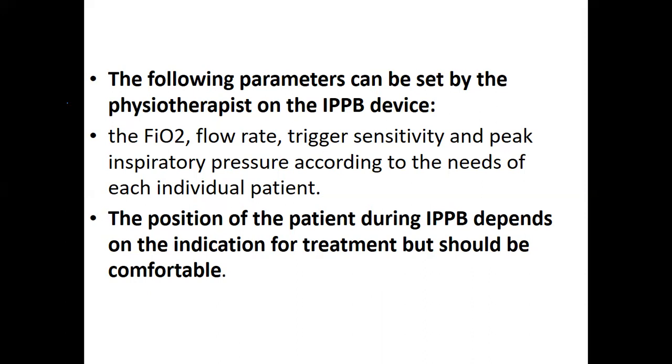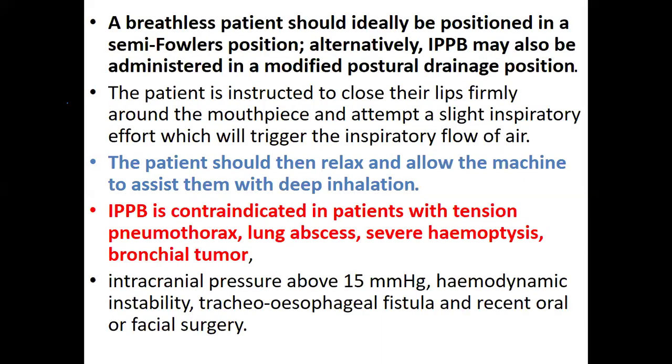So meaning you assess the patient and position them in the most comfortable position. Mostly it could be semi-Fowler's position, in which you can safely administer this technique. The patient should then relax and allow the machine to assist them to breathe after they are put in the position of their comfort, and the machine is connected accordingly.